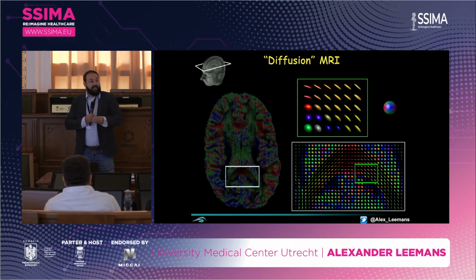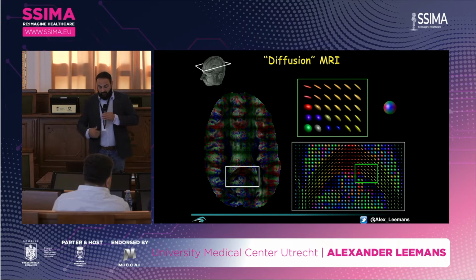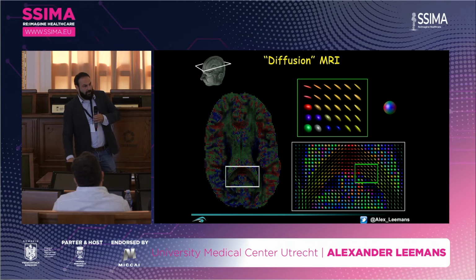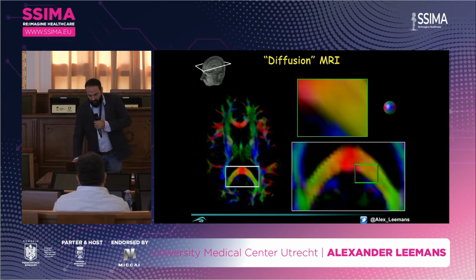So why not map that property directly to a map? Okay, we can do that. And simultaneously, we can also quantify the intensity of that map with the eccentricity of the ellipsoid. So if the eccentricity is very high, meaning a cigar-shaped ellipsoid, we'll give it a value of approximately 1. And if it's very spherical, we'll give it a value of 0. Okay, and then you end up with a map like this.